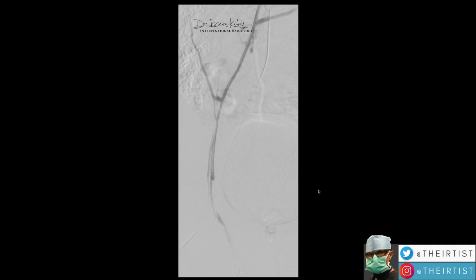So this is the digital subtracted angiographic run we do with our state-of-the-art machine. And I'm going to pause the image so we can discuss it a little bit. So this is the main vein where my catheter is. At this level here, this vein was surgically interrupted successfully. So the surgery at this point is good. The surgeon did a good job by blocking the main spermatic vein.